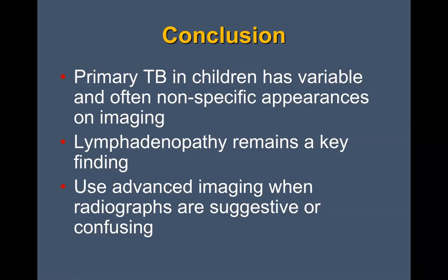I recommend 2-view for everybody. I think you can't go wrong with a 2-view chest. I think there are places where they feel challenged by doing 2-view chests on young children. We have this device called a Pigg-O-Stat, which not all radiologists use, but I think it's very useful because you can put the child in this device, put a plastic tube around their chest, put their arms above their head, and then you can position them very easily.